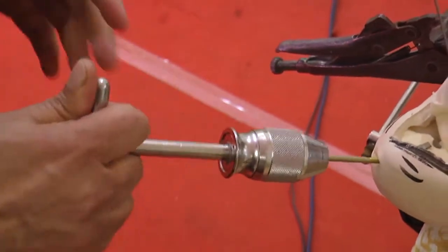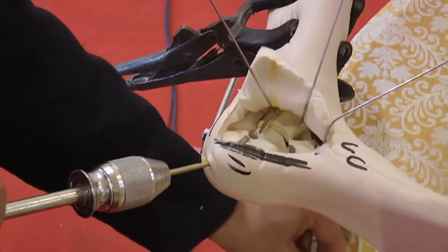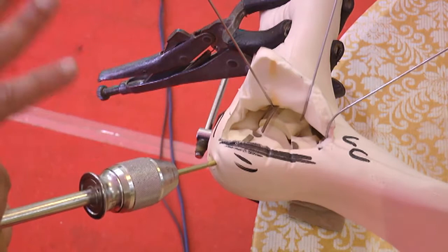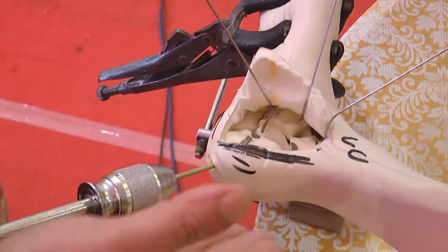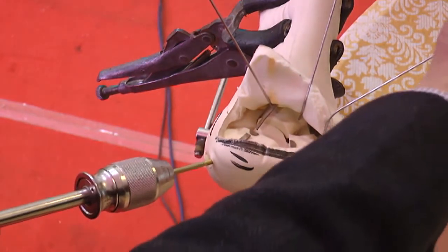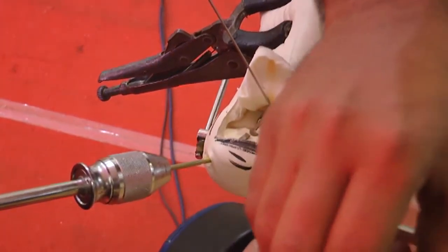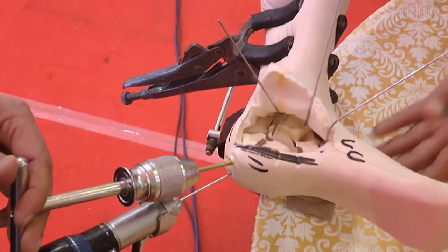So your assistant holds this down and corrects the varus, and you can then put one Steinmann pin or two Steinmann pins or a couple of K wires, thick wires, and that corrects the heel varus as well as the tuberosity inclination and gives you space for the subtalar joint reduction later on. So this maneuver will align the tuberosity to the medial, to the sustentacular fragment. The medial wall will be reduced in the axial view.